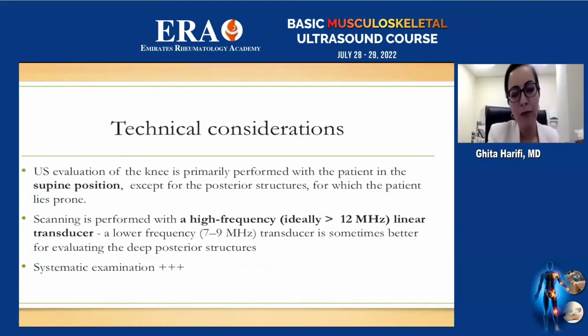Now, the most important message that I can give you regarding the ultrasound examination of the knee is to be systematic. Whether the patient is coming for an anterior knee pain or a posterior suspicion of Baker's cyst, be systematic. Examine the knee the same way you do it for any complaint, which means go with the 4 steps: anterior knee, medial knee, lateral knee, then the posterior knee. And this is what we're going to show you here.